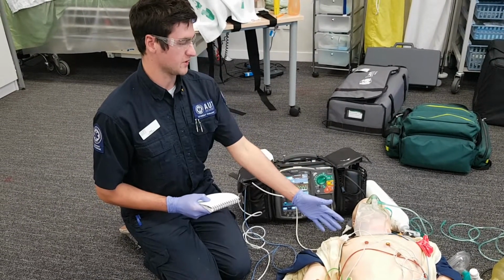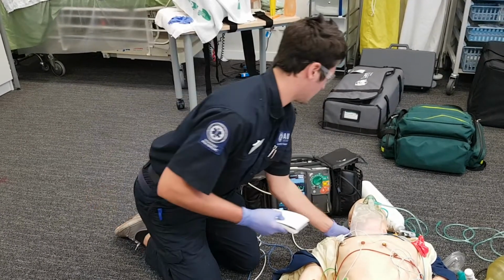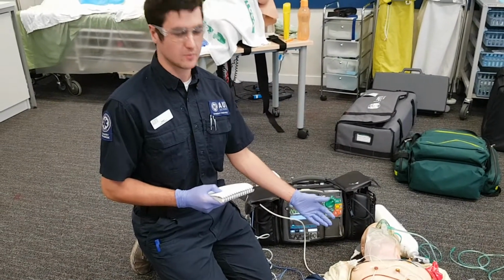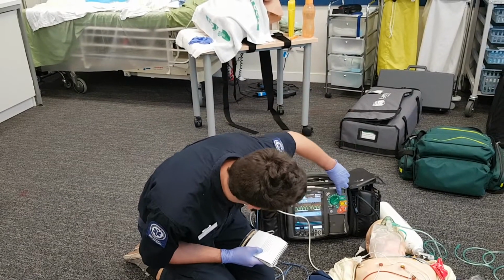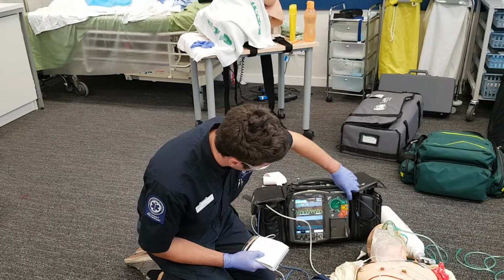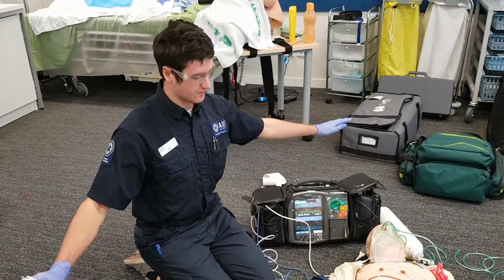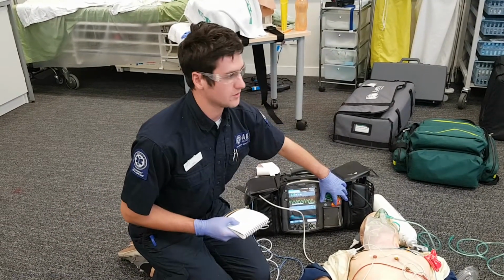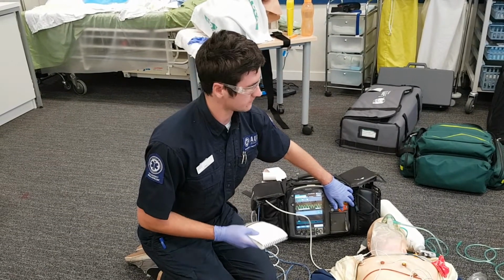I have given my patient adequate sedation, and I will just check again before I cardiovert. Hello, can you hear me? My patient is still unresponsive to pain and voice stimuli. I will select 200 joules, and then I will start the charge. Ensure everyone is clear. Okay, everyone stand clear of the patient, please. And then I will hold the shock button down until the shock is delivered.